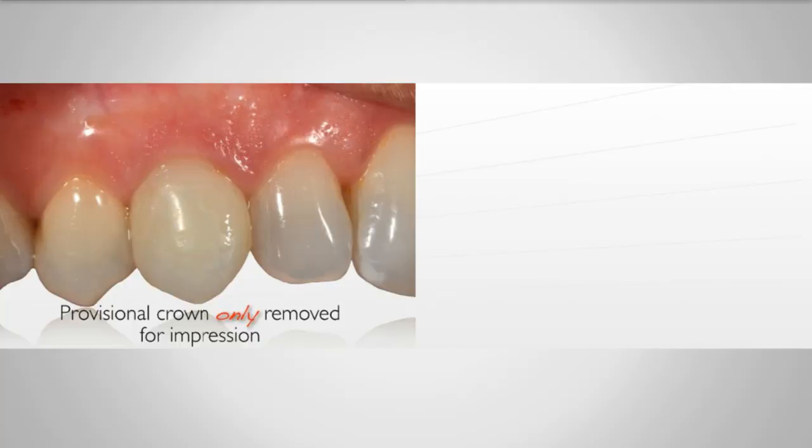One more question. Do I find balance in the occlusion in the canine area site more demanding than other aesthetic area sites? Any thoughts? Well, the occlusion, in this case, yeah, because her other canine was out to the buccal and she had a deciduous canine on the right side. She did not have a canine guided occlusion, so I was not going to build that in this case. We kept her in a group occlusion.